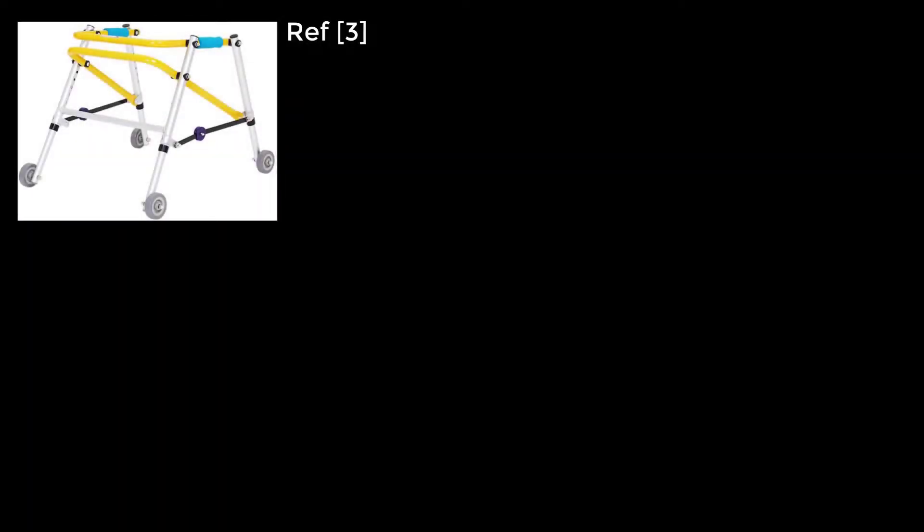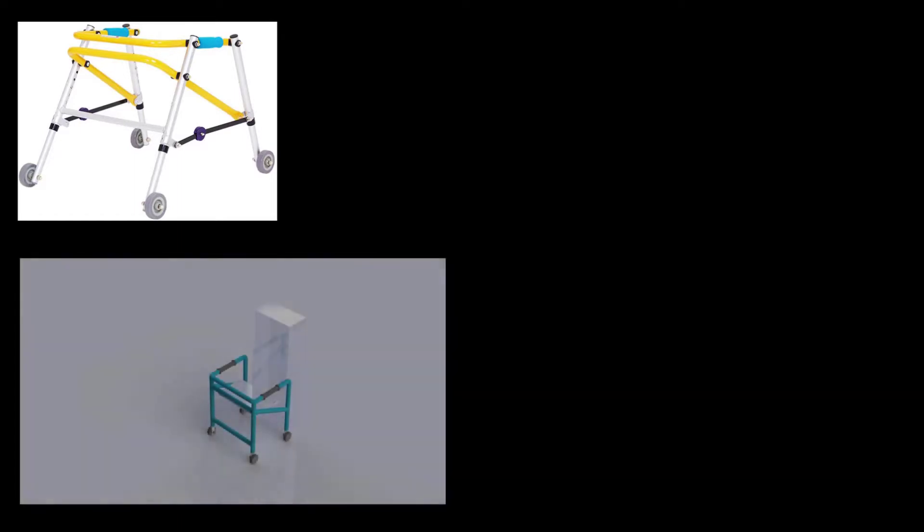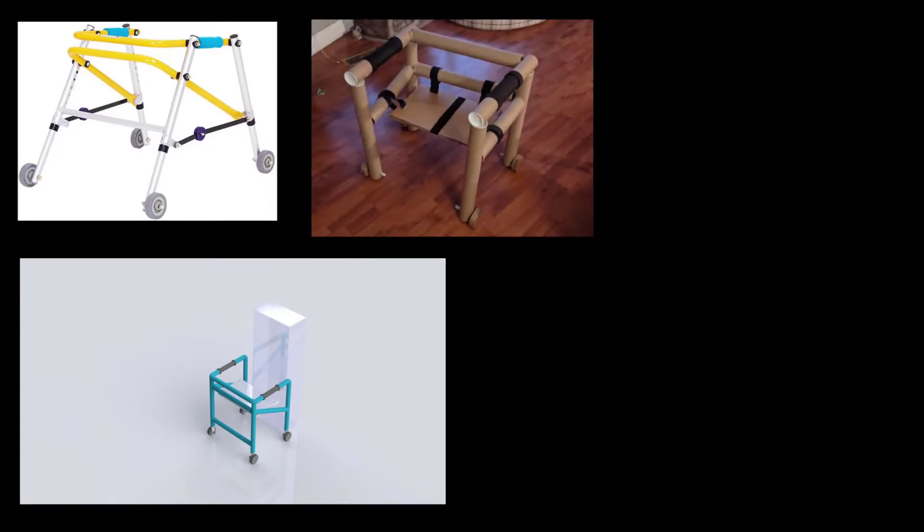Our design process had a couple of different iterations. We began by researching existing solutions and used a basic frame as a foundation to build upon. We began with the soft design, where we created a fully functional walker in SOLIDWORKS that would be ready for manufacturing, made of durable materials like aluminum. And then we had the hard design, which was our physical prototype, built close to the scale of our soft design, and was built out of cardboard.